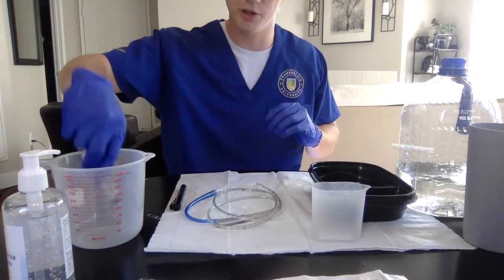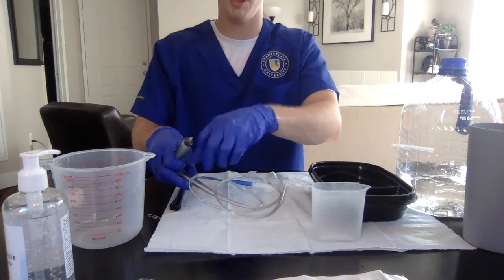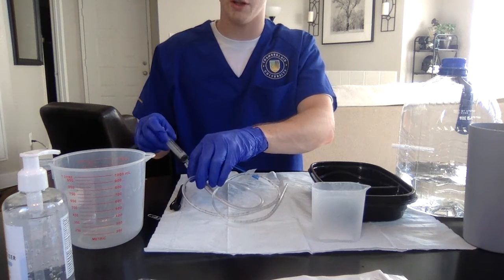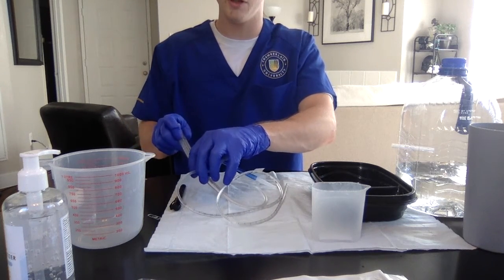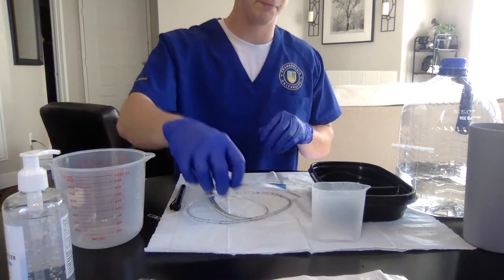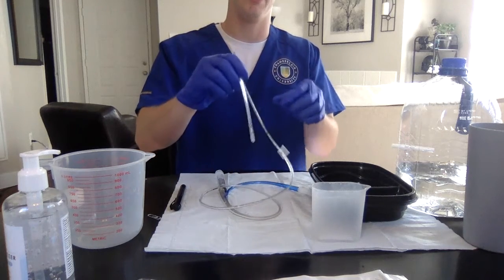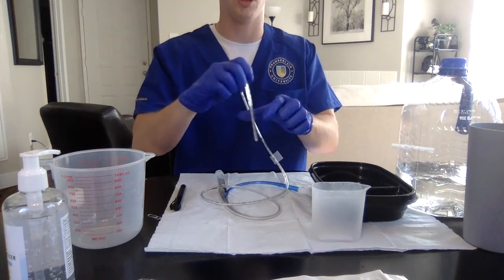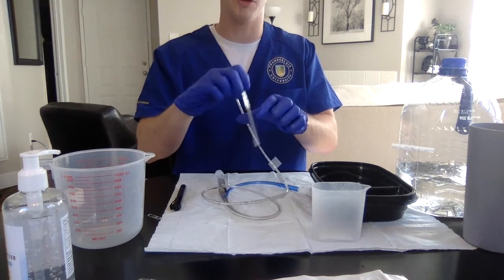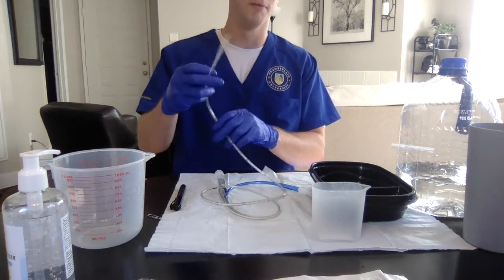So now we are going to insert our syringe into our tubing here. We're going to do this ahead of time just in case there is any leakage of the gastric contents. We want to make sure that we're prepared for that. And then we're also going to dip the end of our tubing here into our lube. We're going to give a generous amount to our client just because we are sticking something up their nose and it is going to be uncomfortable.